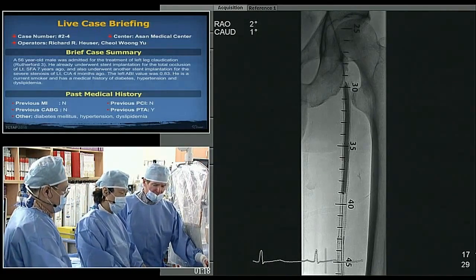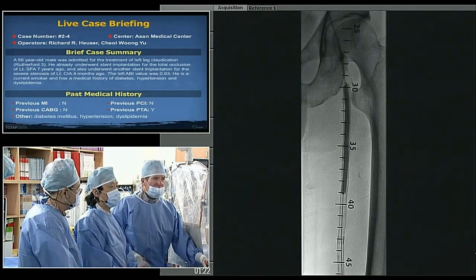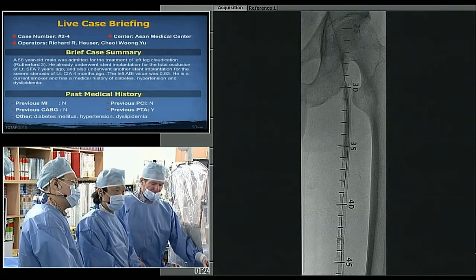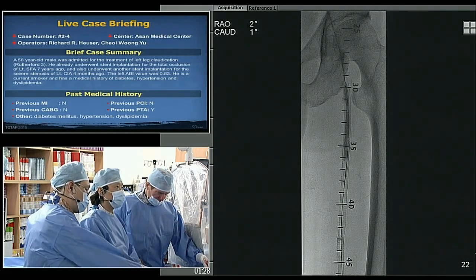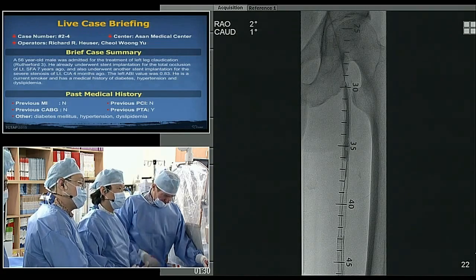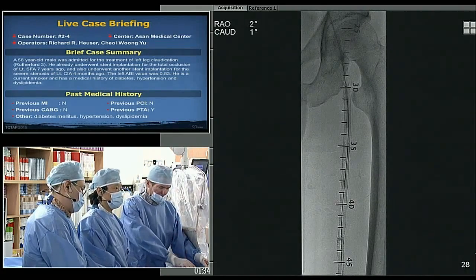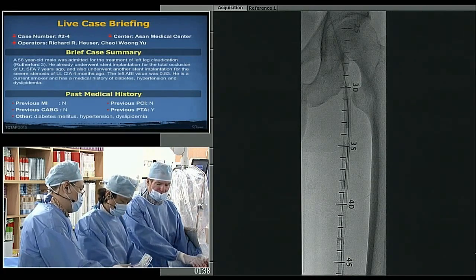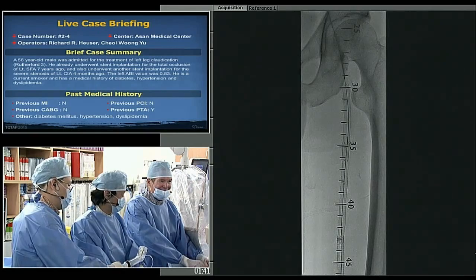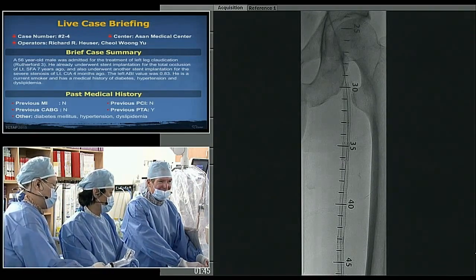Do you have any data about the kinds of strategy in restenosis? Is debulking and then the drug-coating balloon strategy superior to any other combination of therapy? Personally, I have no idea. What do you think? Theoretically, that strategy is very optimal.